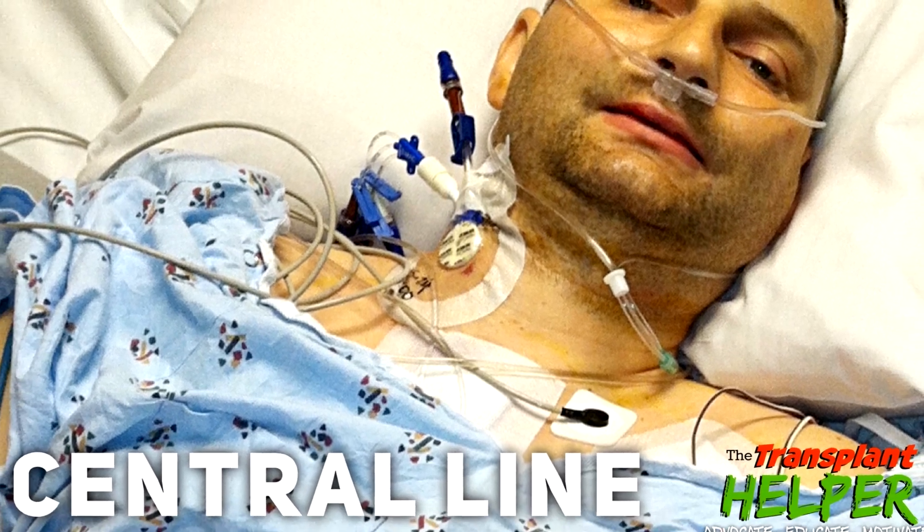The next one is a central line, which is a little bit different. A central line can be used for the same purpose — delivery of medications quickly. Central lines are often placed either in the neck — and it can look a lot like the Swan-Ganz when placed — although it usually only has two or maybe three lumens coming out of it. It can also be placed in the chest area, similar to the port, going through the skin and into the body through the larger veins. The difference between a port and a central line is that the central line has lumens sticking out — little lines you can tap onto like an IV.